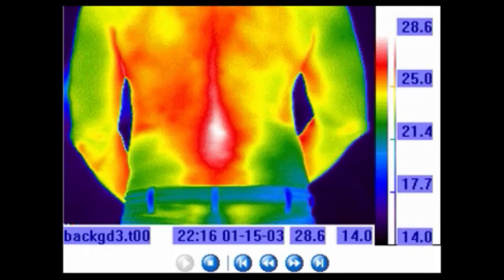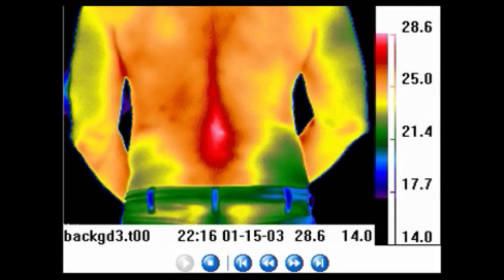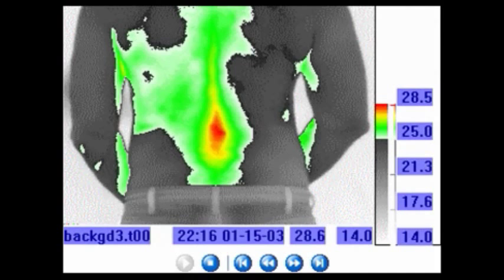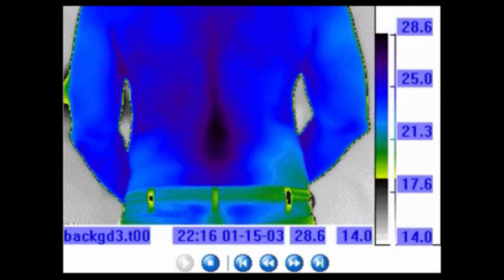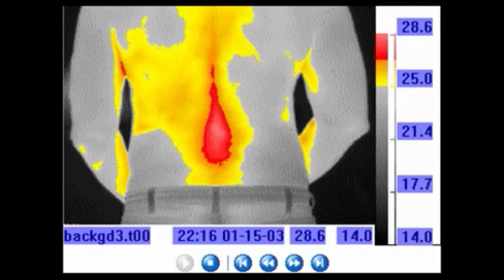The top color in the color bar to the right will always be the hottest temperature value. See the variations with the lower thoracic and lumbar areas.